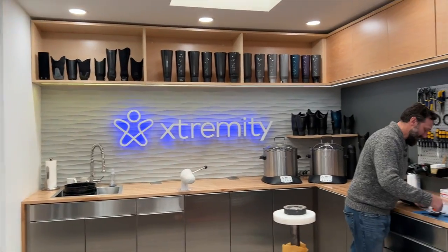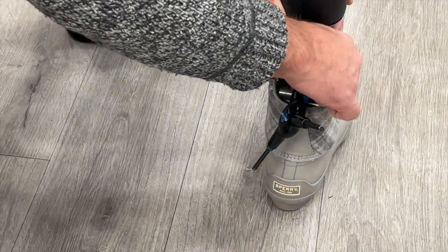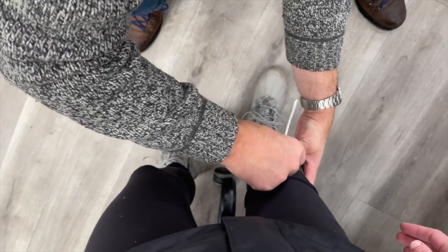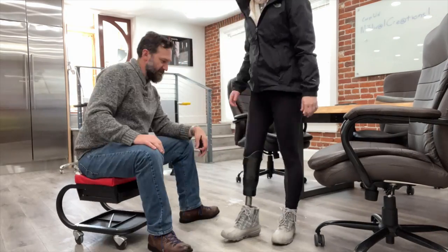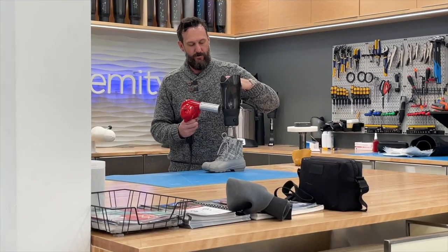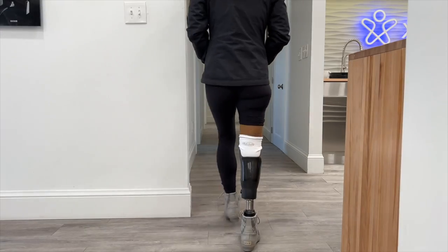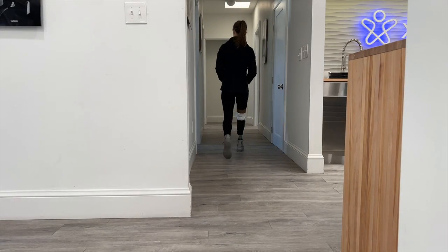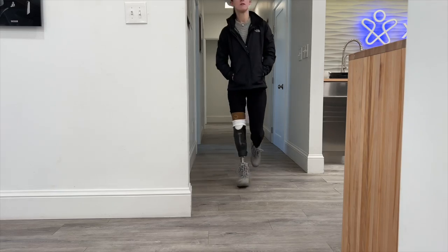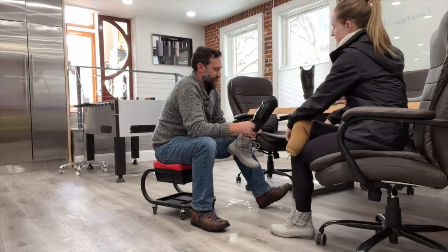Now, there are a lot of different pieces that go into a fitting. It's not only how it feels on your leg, but also the alignment of the ankle, the height, how you're stepping, things like that. So we spent a while tweaking that, getting it right, using the heat gun to make quick modifications to make it more comfortable, which is something super cool that these sockets do. If you're interested in hearing more about that, check out the video I've linked down below. But after about an hour, I was ready to go, and honestly, I really liked it. I took it home for the weekend over the holidays to really give it a shot and see what I thought about it in daily life.